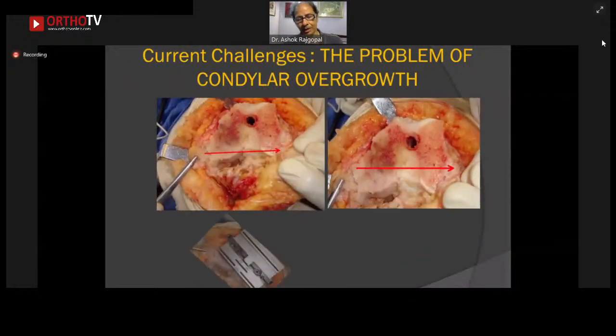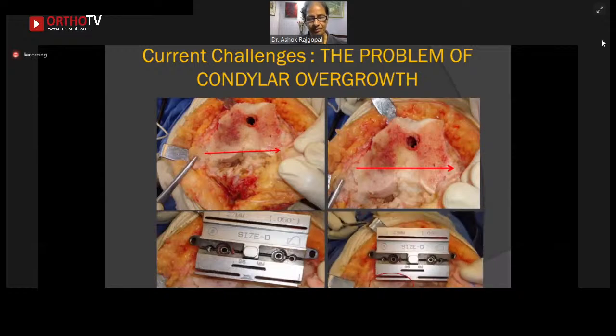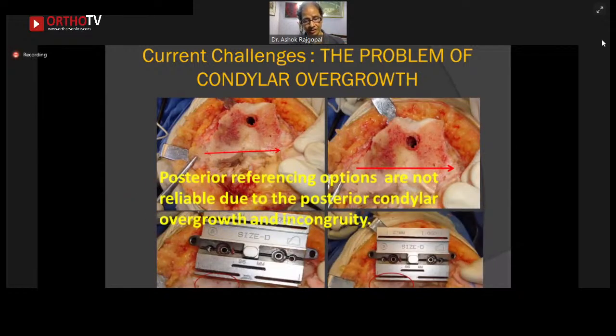Here is the critical issue. We're talking about the varus knees. Severe varus knees will always have a compensatory or adaptive posterior condylar overgrowth. And this is the reason why we have always made a big point about using anterior referencing system, as you can see over here.